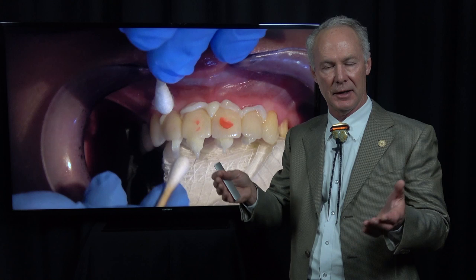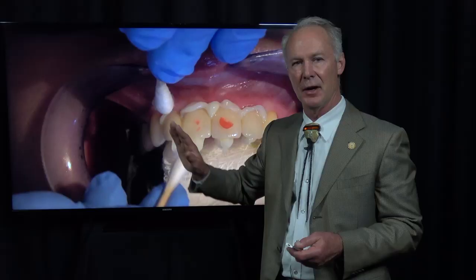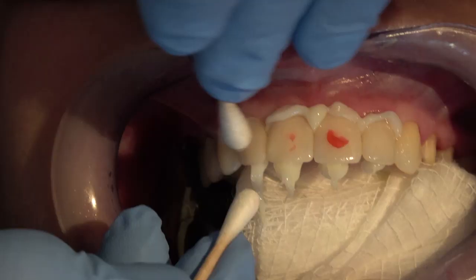So the best way to eliminate that is break it off once it has initial cure. Don't ever wipe it off. That's with crowns or with veneers. Chip off the excess luting composite. So how do we set that and make that happen?